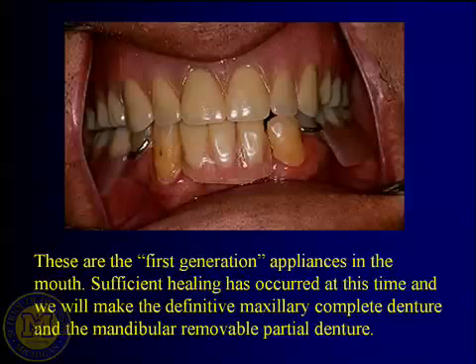So when you look at somebody, whether it's a complete denture or a combination case or whatever, spend some time remembering and garnering from the patient what they like or what they don't like about their pre-existing appliance. Too often I see students take it out, put it over at the back of your cubicle, and never look at it at all. And then suddenly when you go to select teeth or you go to talk about those things, it's like this whole brand new thing out of the blue that you've never even thought about.